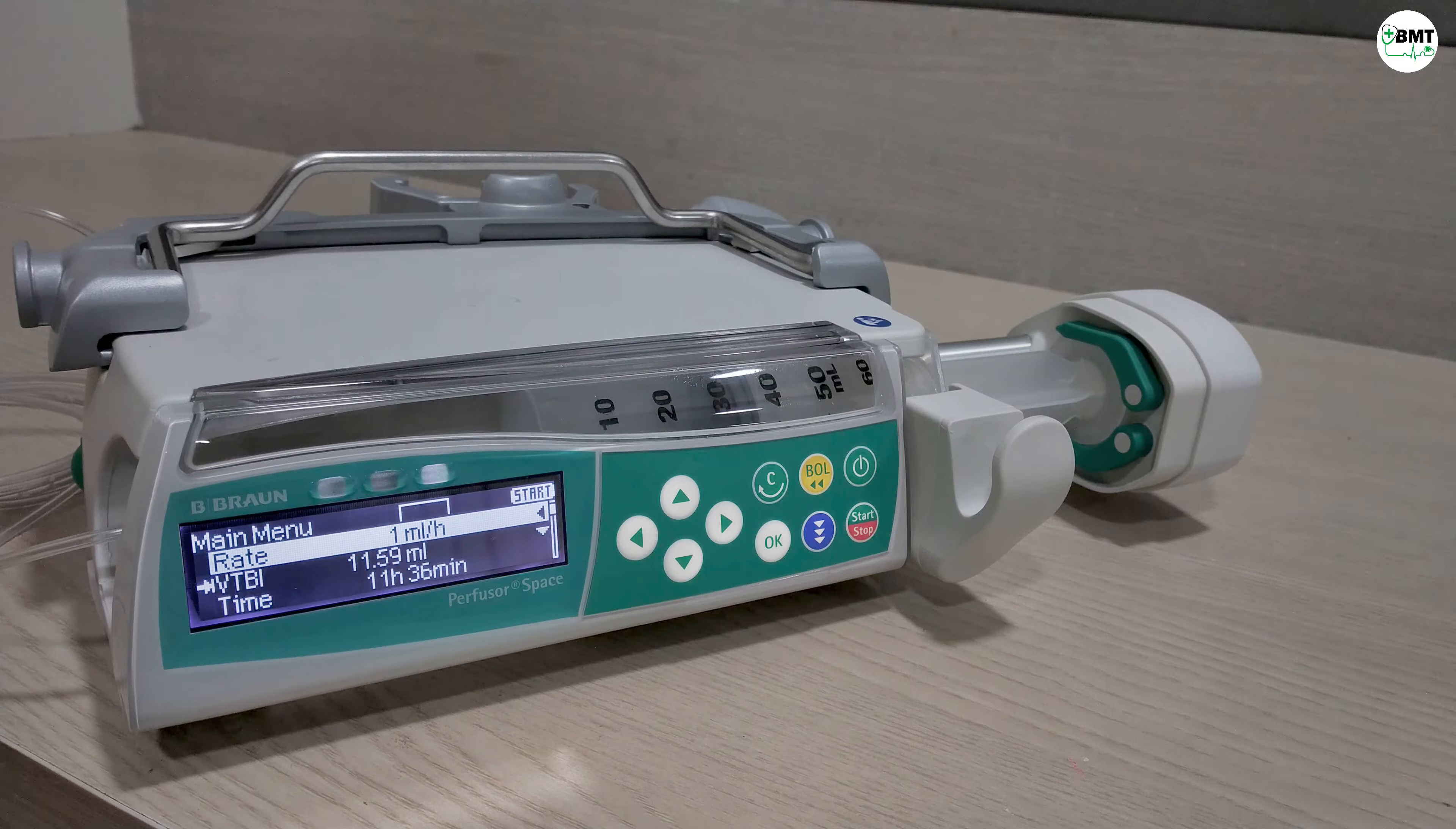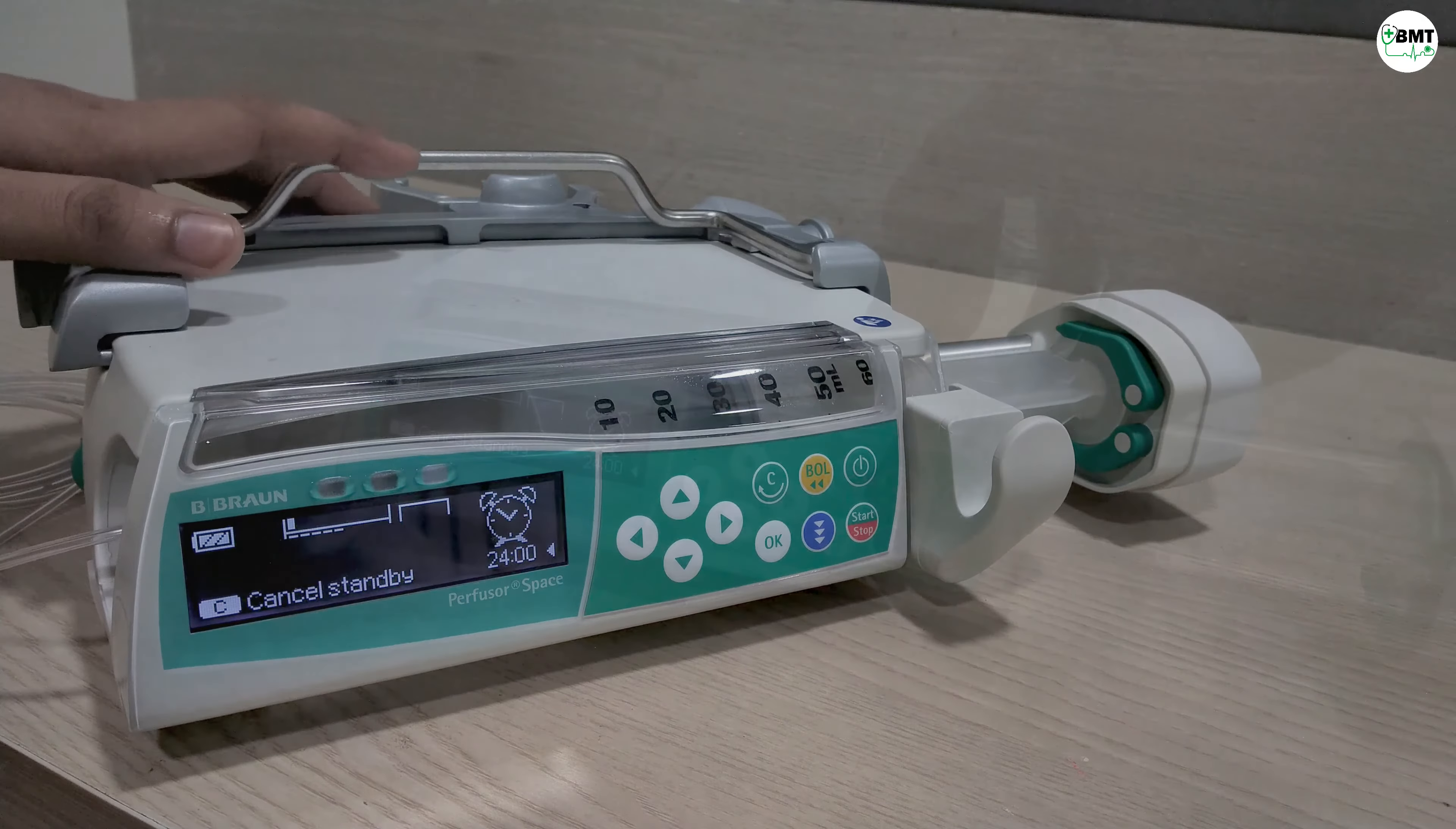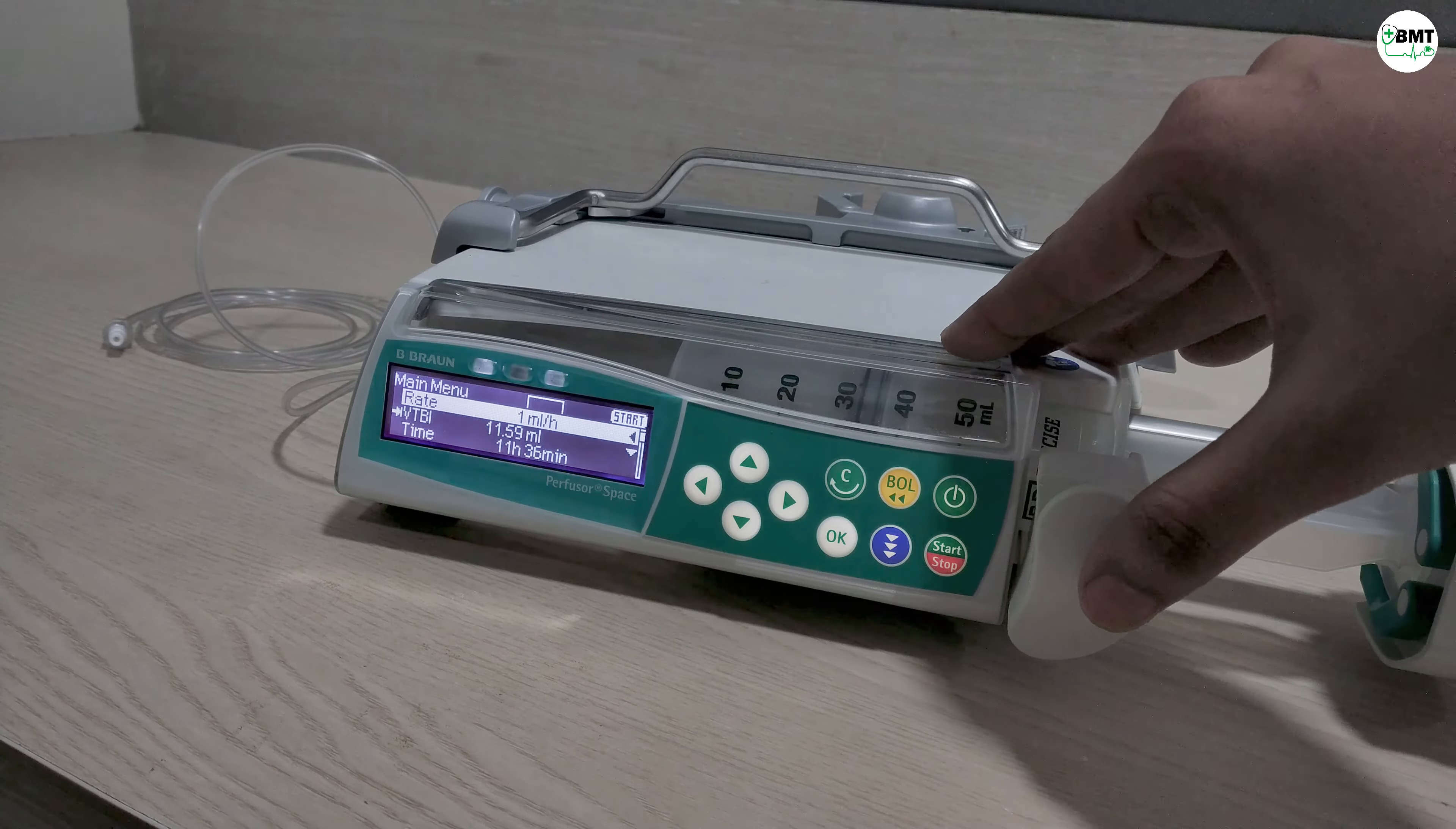If you want to put this syringe pump in standby mode, press the on-off key for 3 seconds. It will go in standby mode. To cancel standby mode, as instructed, press C and then normal screen will appear.